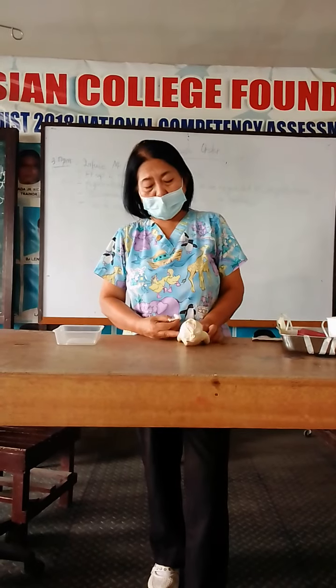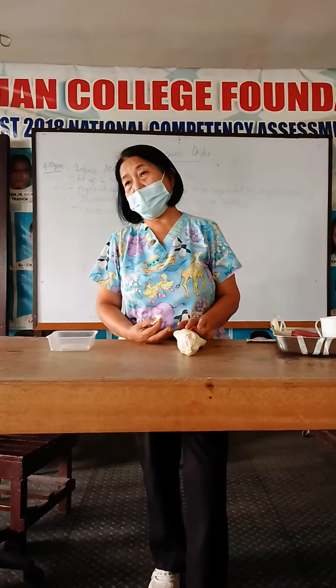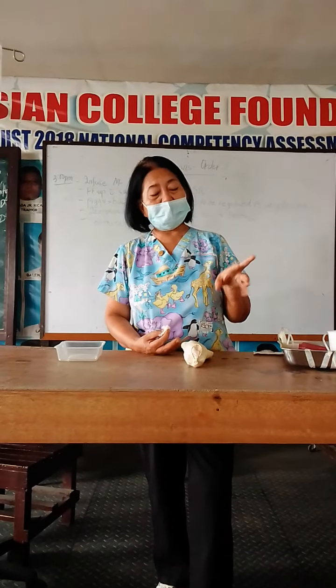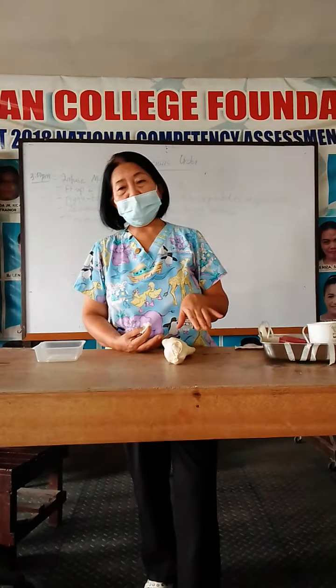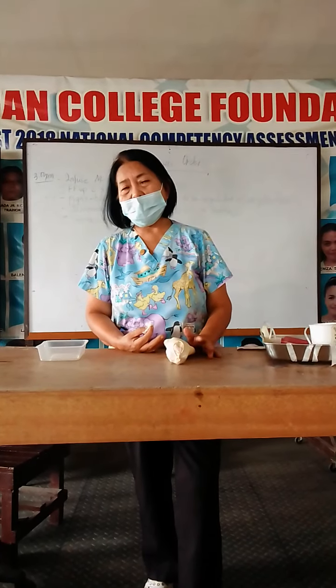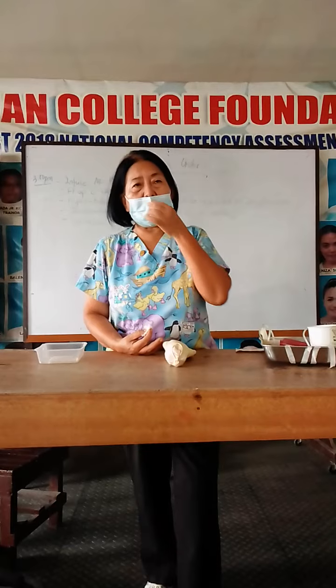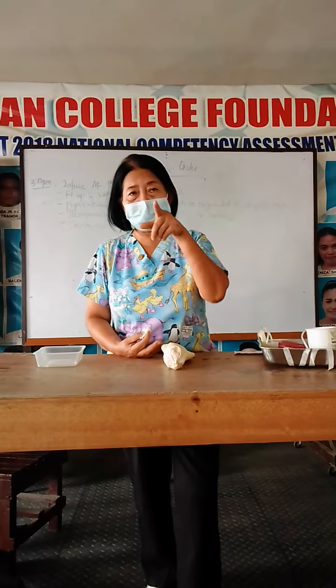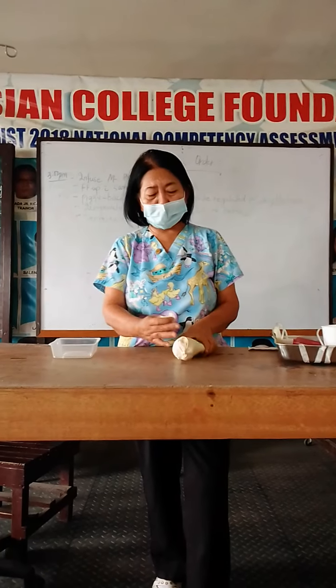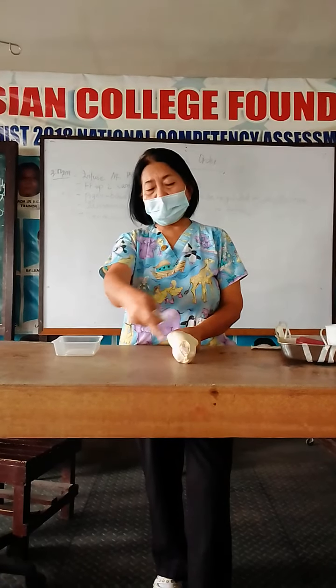So I have selected already an accessible vein, and a vein which is straight, and a vein that has no hair in the surrounding area. Then, there are no scars, there are no hematoma, no insect bites. A straight vein, not a corrugated vein. And then, tourniquet there.